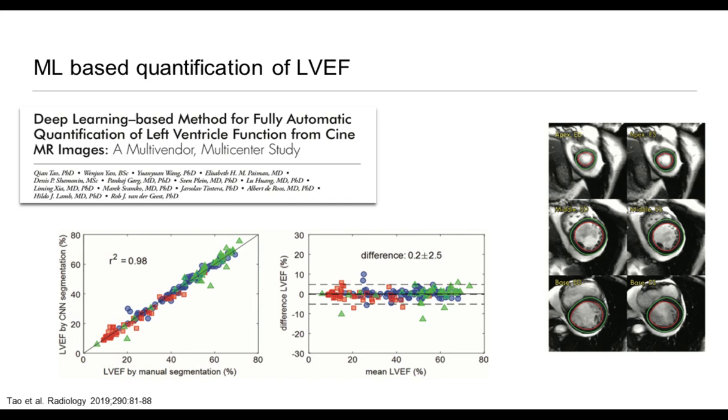And in addition to allowing for precise quantification, it also allows for much faster analysis of the images. So basically, when the radiologist or cardiologist opens the scan, the results can already be present for extraction and being put into the scanning report and the radiology report. The editorialist who reviewed this paper notes that this is strong evidence for the value of this technique.